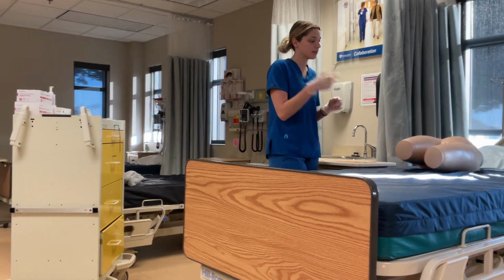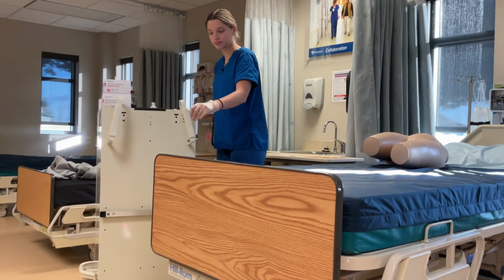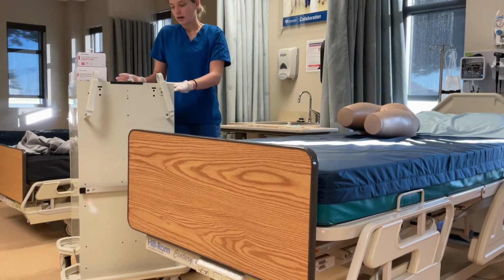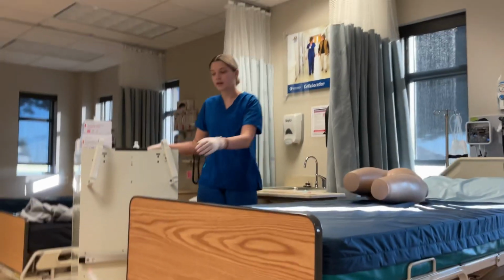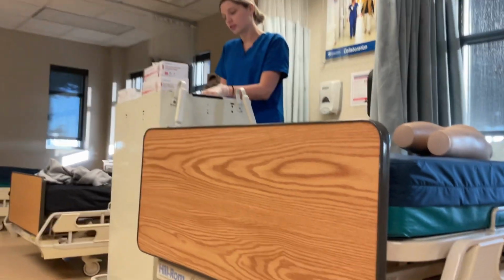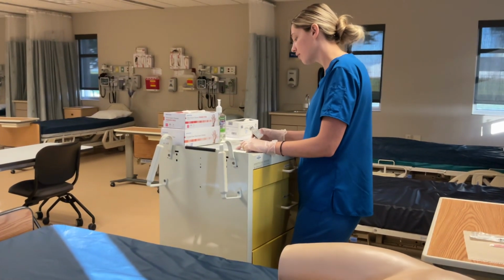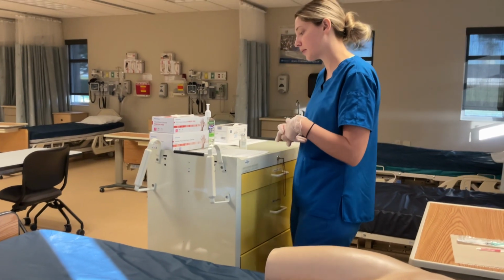So then I would scan the patient's wristband, and I would also scan the medication that's going to be given. Scan the medication, and then I'm going to do my third check at bedside. So I will do right patient, Joe Smith, right medication, ketorolac, Toradol, 30 milligram IM, every 6 hours PRN for moderate to severe pain. And it has not been given yet today, so I'm able to give it.